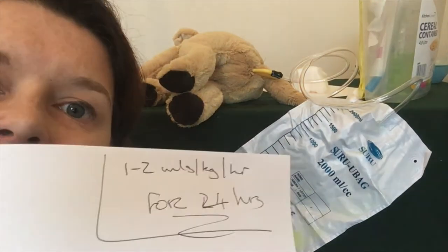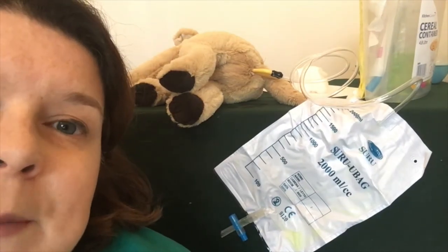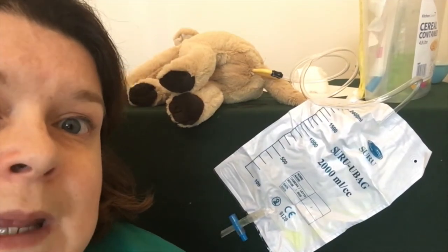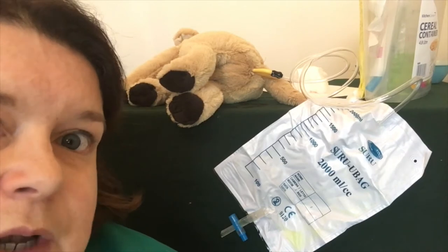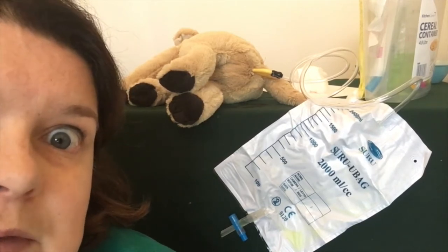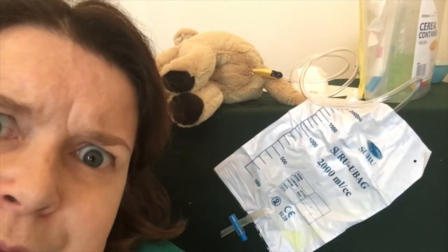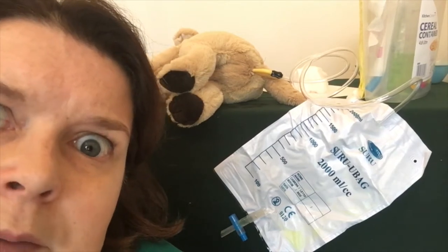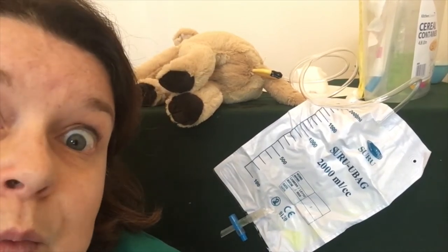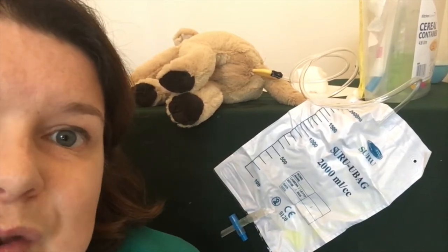You could do the calculation at the start, because you're not being asked to comment on whether the amount of urine you get is normal — you're only being asked to comment on its characteristics: colour, smell, and clarity. So it's not that you would say 'oh I only got 50 mils, that wasn't enough.' You're purely being asked to demonstrate that you know what it should be in 24 hours. So make it easy on yourself.